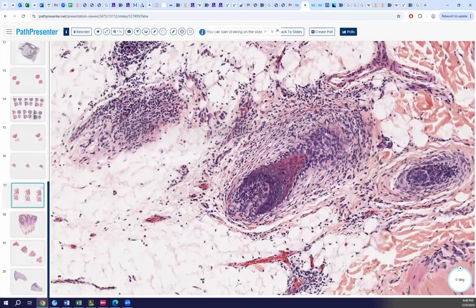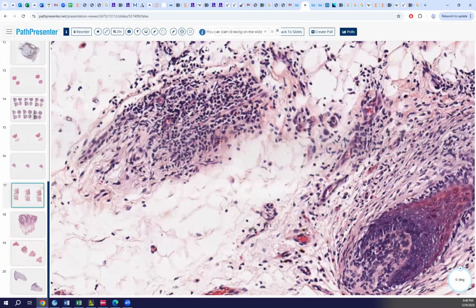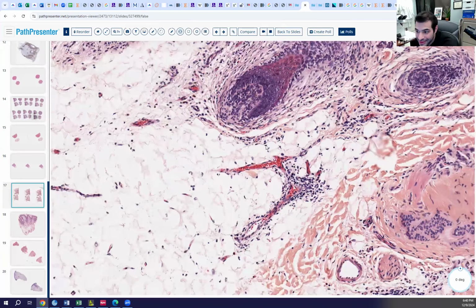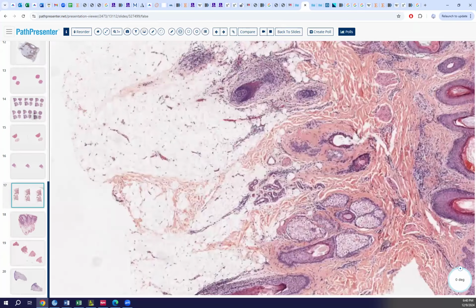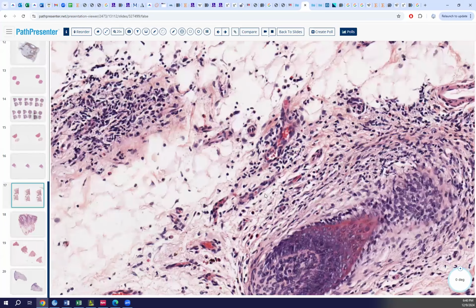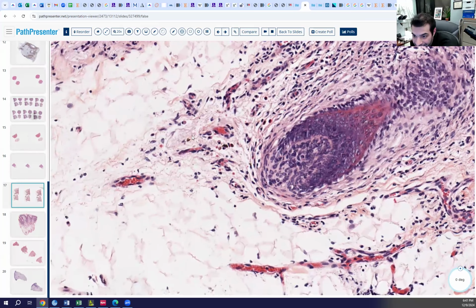Inflammation. Okay, where is it? Bulbar inflammation. All right. There's bulbar inflammation, I agree. What kind of inflammation? Lymphocytic? Yeah, there is lymphocytic inflammation here. There's something else. There are some other things here too, though. Plasma cells? There are plasma cells.